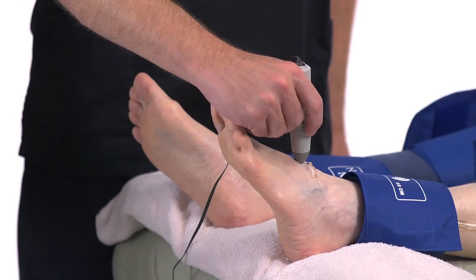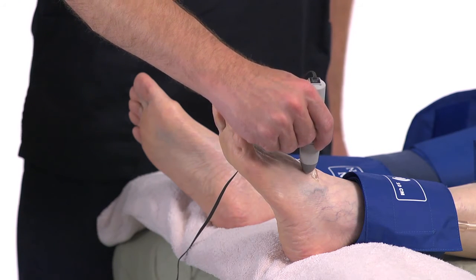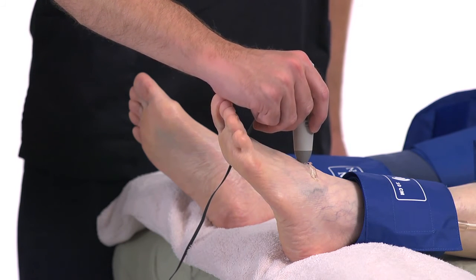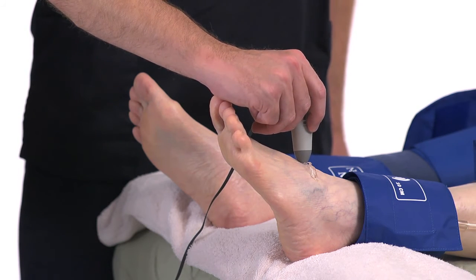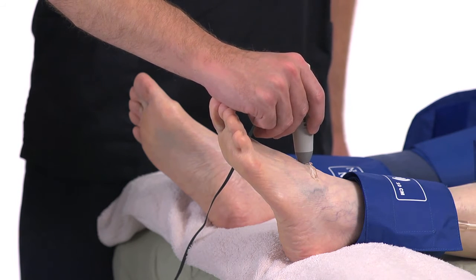For the dorsalis pedis, or DP, find the artery by putting your finger between the bones of the great and next toe and slide towards the ankle until you feel the pulse. Again, use plenty of gel and move the probe back and forth to find the loudest arterial sounds. Be sure not to press too hard here, as the artery lies over metatarsal bones and can easily be occluded by pressing too hard with the Doppler probe.